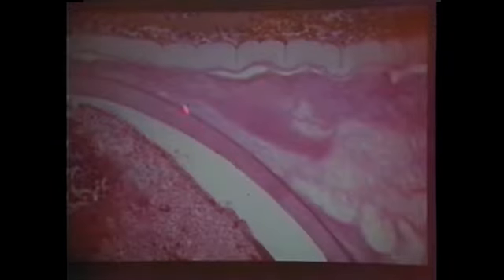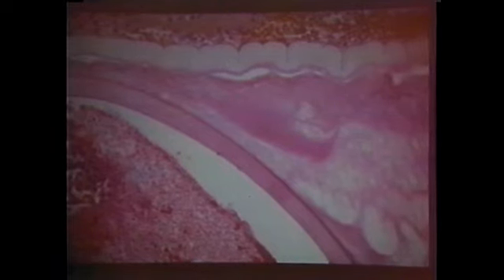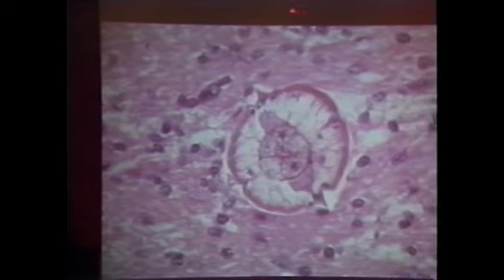Look at this. Here we go. Is this a thick cuticle? Yes, it's thick. It's a longitudinal section, and look how it's kind of folded. First of all, you're going to want to practice learning your morphological characteristics, and then you want to add on to that even tinier morphologic characteristics. So, this is a thick cuticle. This one we can't see. It's thin. But you can see at the lateral area, and I'll tell you later how you can tell it's the lateral area, that the cuticle is pulled out into some points, some alae. This is a thick cuticle.